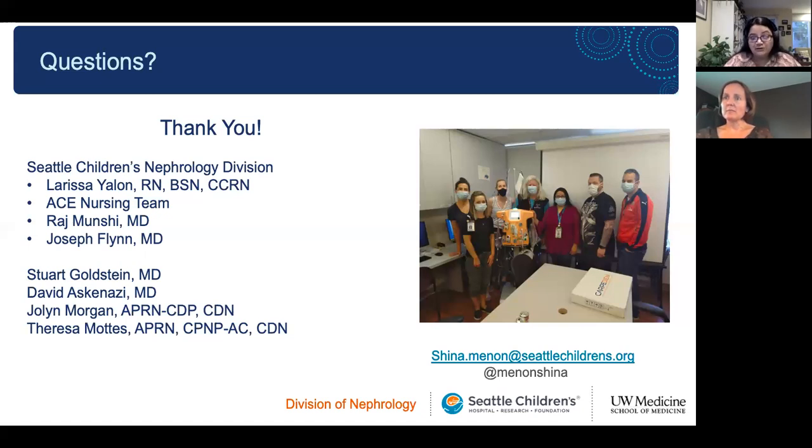No, actually not. That's a very good question, but we have not had that issue. When you look at convective clearance, which is what Aquadex provides, versus dialytic clearance, I would say probably convective clearance is slightly better. The middle molecules can be removed through that, whereas dialysis would only target the smaller molecules. Convective would target both the small and the larger molecules, so you would end up getting slightly better clearance. Studies which have looked at CVVH versus CVVHD versus the combination didn't really show much difference in outcomes with either of the therapies.